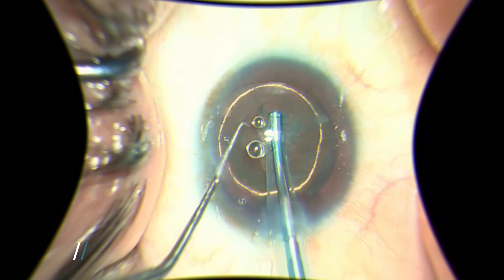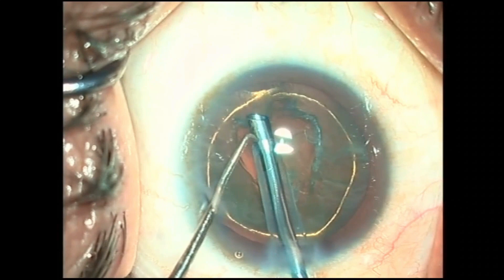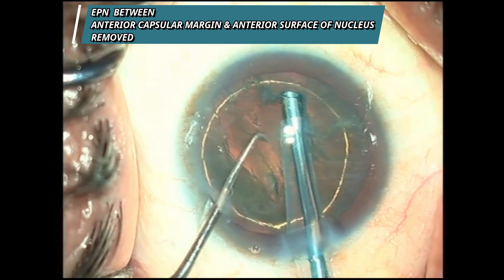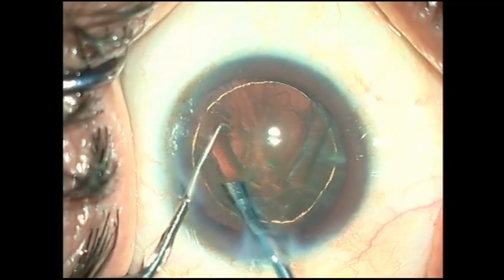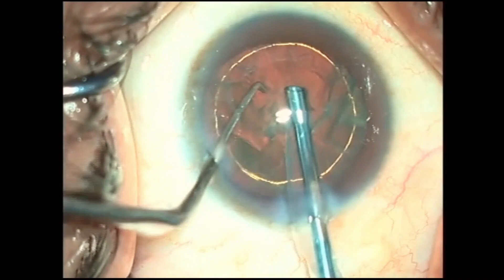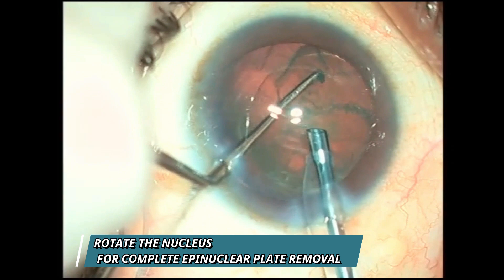Now let's talk about how we can overcome this problem. In this video, we are removing the anterior part of the epinuclear plate within the rhexis margin, as in our routine cases. We suck the part of the anterior epinuclear plate between the anterior surface of the nucleus and the capsule. Place the phaco tip close to the rhexis margin and apply suction — no phaco energy is needed. A vacuum of 300 ± 100 mmHg is usually enough. The epinuclear plate can be easily removed up to 200–220 degrees without rotation of the nucleus.